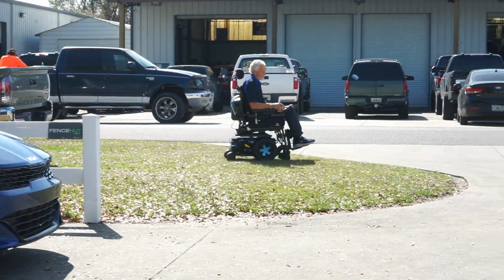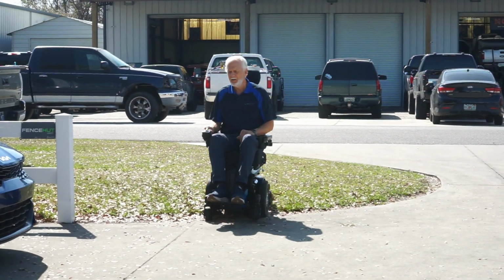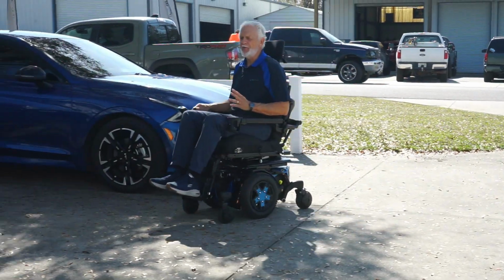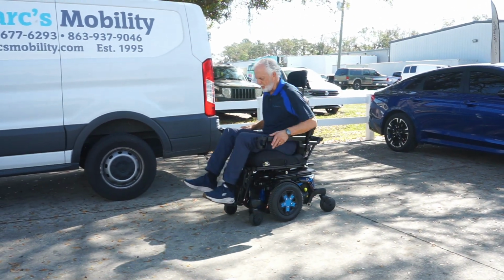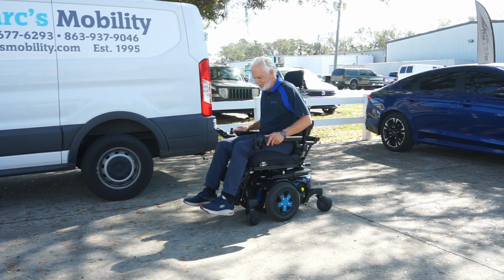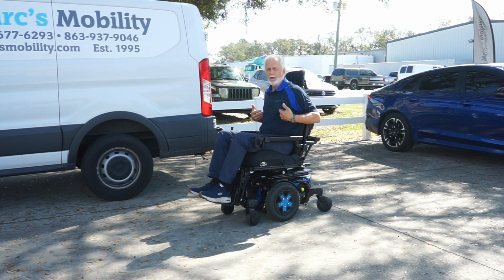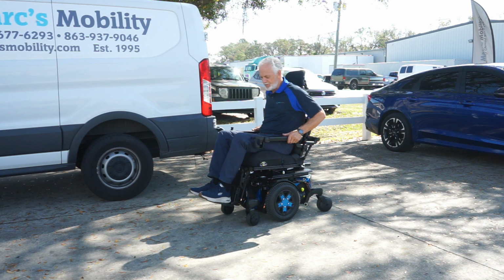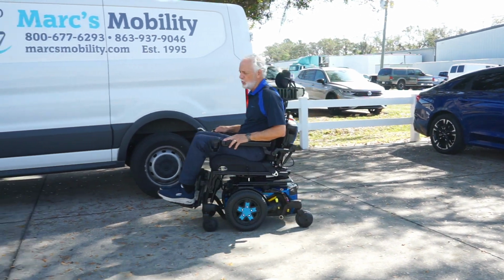Now I'm 6 foot tall, 184. 6 foot tall, it almost fits me. The only thing we would have to do if it was my chair is lower the foot plate down so my knees would be more like this instead of up like that. But that's all adjustable. So like I'm 180. If I want a small chair for inside, I have room on each side. As I said, it all depends what you want to do.